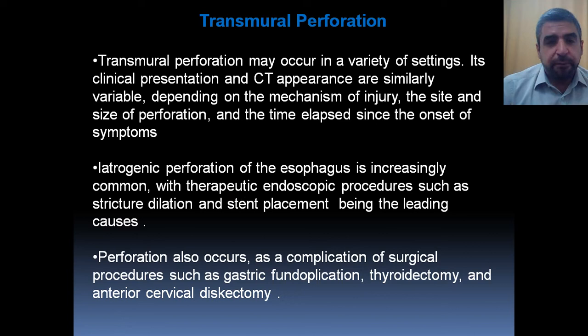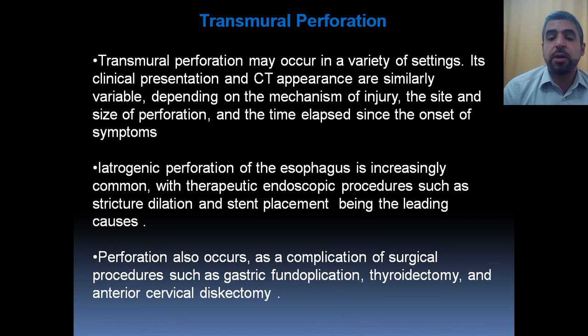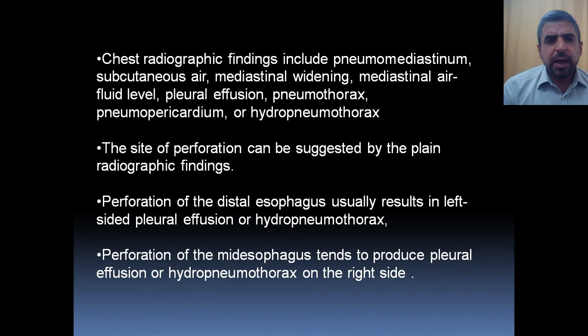Transmural perforation is the most catastrophic event and may occur in a variety of settings. Clinical presentation and CT appearance depend on the mechanism of injury, the site and size of perforation, and the time elapsed since onset of symptoms. Iatrogenic perforation of the esophagus is increasingly common — therapeutic endoscopic procedures like stricture dilatation and stent placement are the leading causes. It can also occur as a complication of surgical procedures like gastric fundoplication, thyroidectomy, and anterior cervical discectomy. Chest X-ray will show pneumomediastinum, subcutaneous air, mediastinal widening, mediastinal air-fluid level, pleural effusion, pneumothorax, pneumopericardium, or hydropneumothorax.